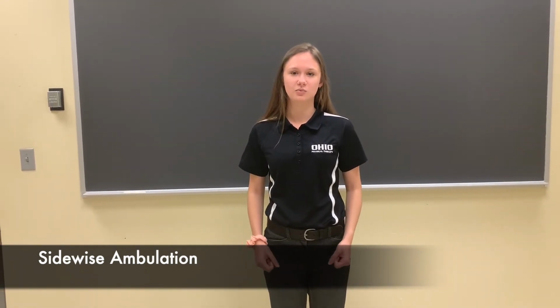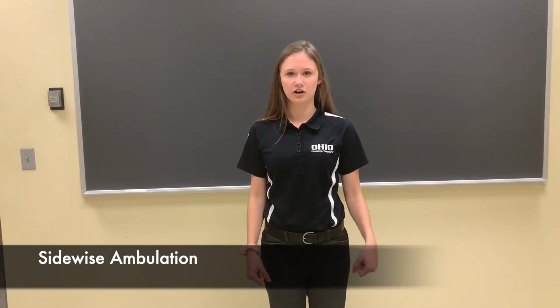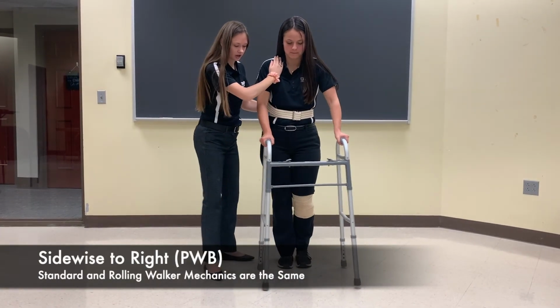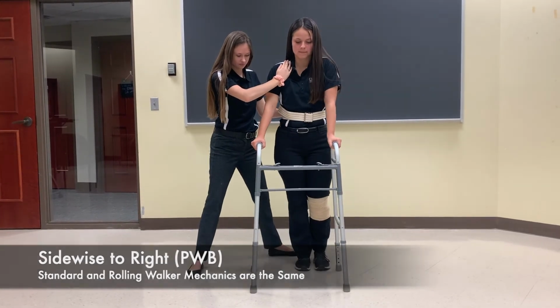If it is a non-weight-bearing scenario, then the patient will have to push all their weight through the walker to move the one limb that is available to move to the right. Right leg, left leg, walker, right leg, left leg, walker.